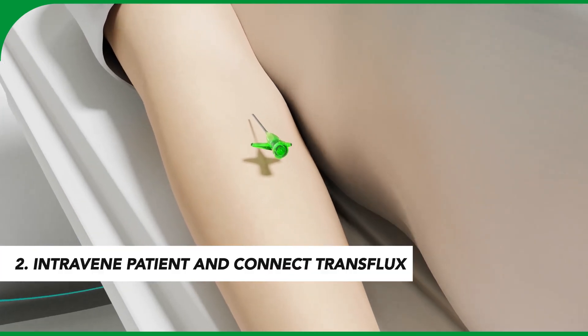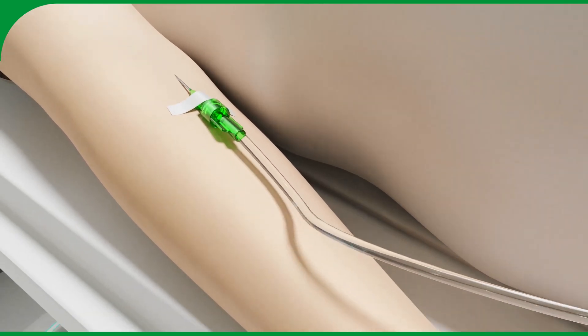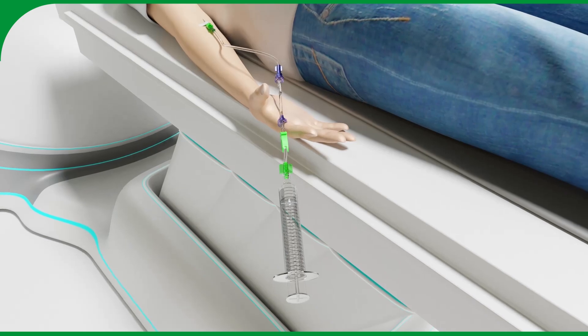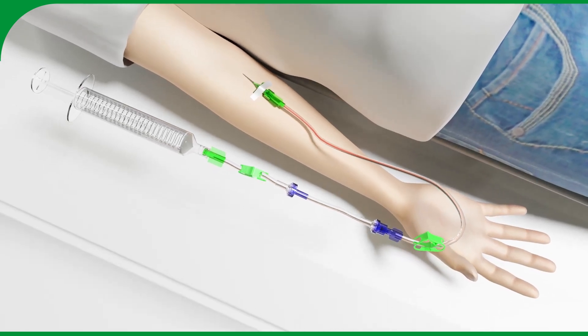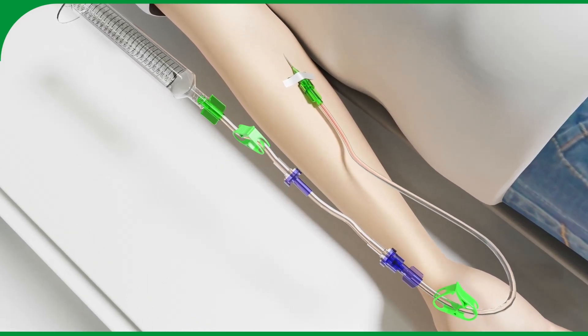When the catheter is established in the patient's vein, the trans flux can be connected to the patient. Once attached, the blood reflux can be checked by disconnecting the one-way valve. This disconnect feature can also be used to access the vein in case of emergency, or to intravenously administer drugs to the patient without the risk of extravasation.